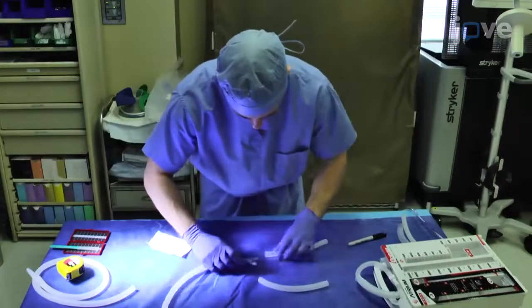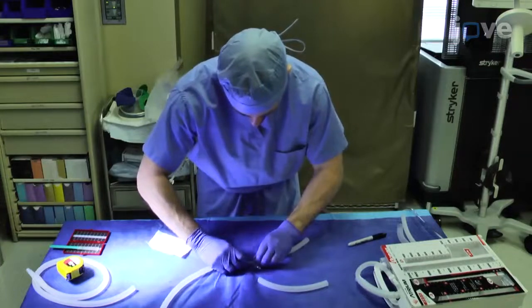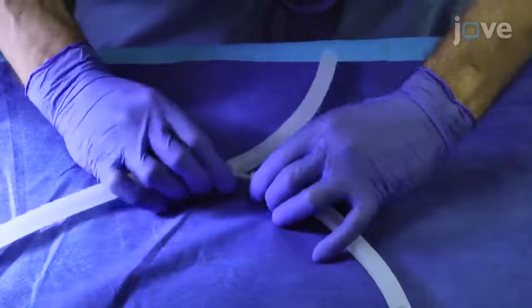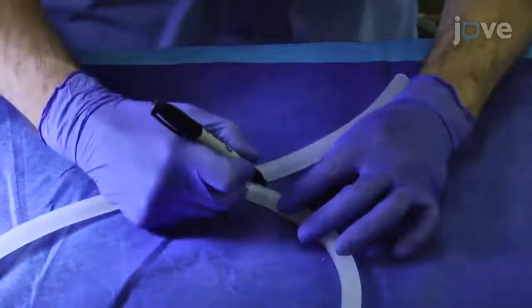Using Y connectors, connect two approximately 12-inch pieces of tubing for the right and left common iliac veins and two approximately 12-inch tubes for the common iliac arteries to the vena cava and aorta.